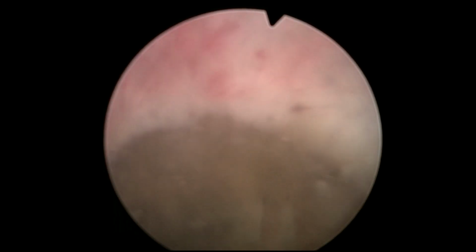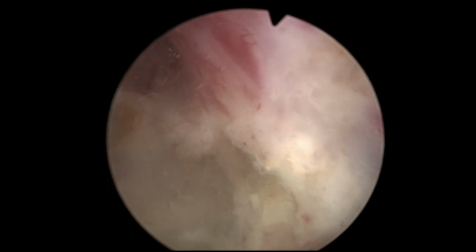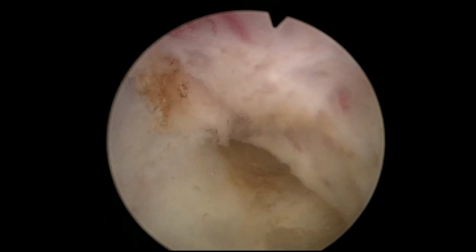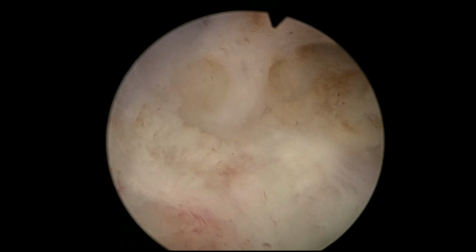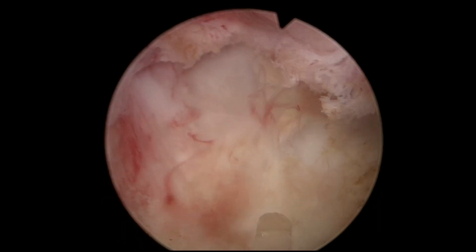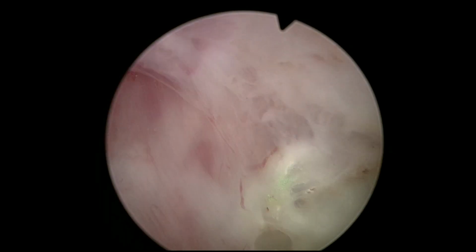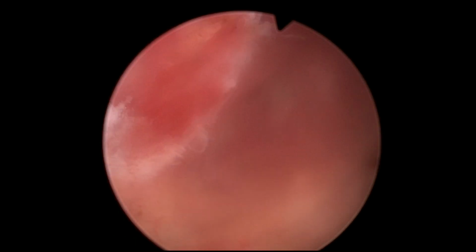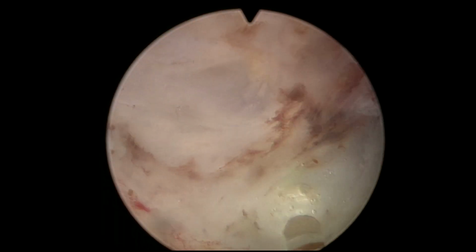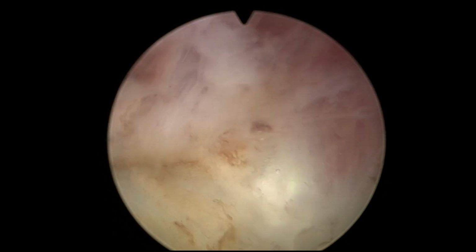Basically, the main difference is that the peak power, the peak energy that the laser emits, is significantly lower with thulium lasers. So the heating of the water in the tip of the fiber is going to be less abrupt, and the subsequent typical explosion that happens with holmium will not happen as much with thulium laser. So thuliums have longer pulses, and the peak power is much lower than what we can have with holmium laser.